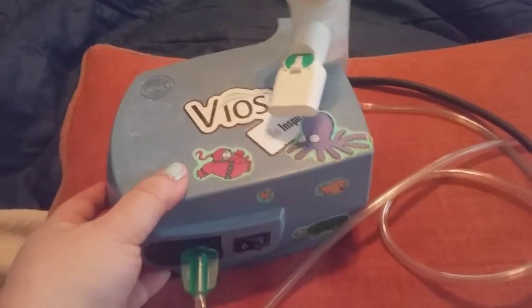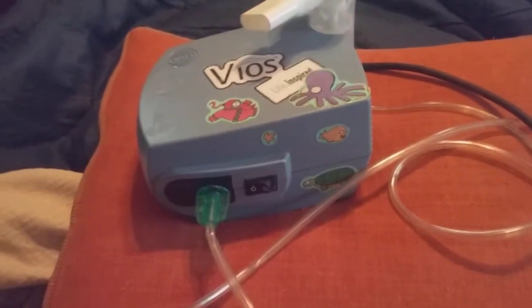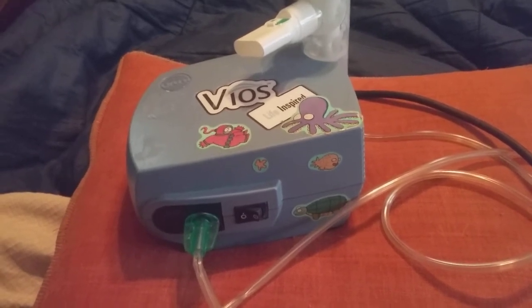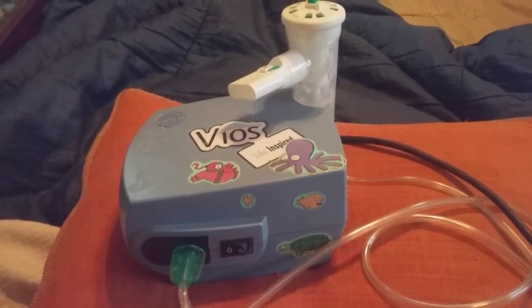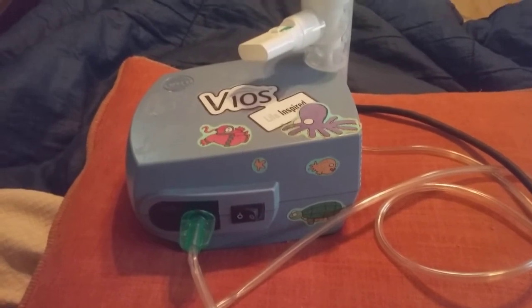Again, this is the VIOS Life Inspired Nebulizer. It retails for $74.99 online, and I got mine through my insurance. So make sure if you have asthma or COPD and you need a nebulizer, give this one a try — it's one of the best ones I've had.